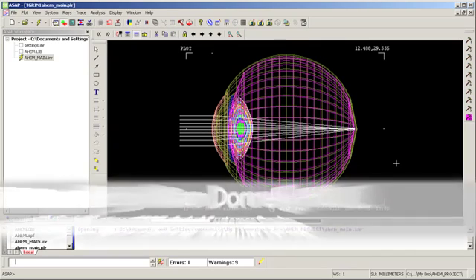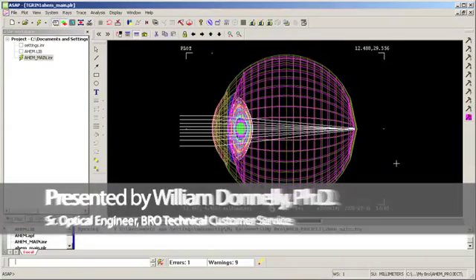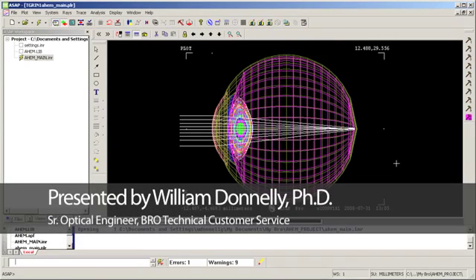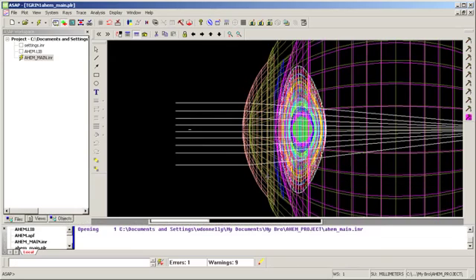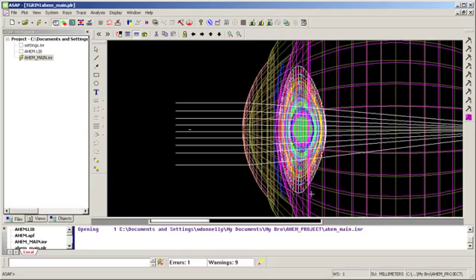We're now going to use the eye model to create a gradient index lens inside the eye. So I'm going to zoom in, and we see that the eye lens has a multi-layered structure, just like the real eye.